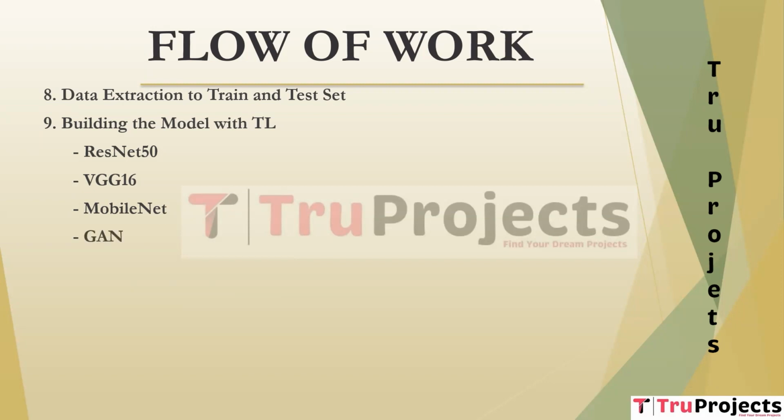GAN, which is Generative Adversarial Network. It consists of two neural networks, a generator and a discriminator, trained together in a competitive manner. This can be used for various tasks including image generation and enhancement. Training the model and building. This phase includes training the transfer learning models and making them ready for evaluation.